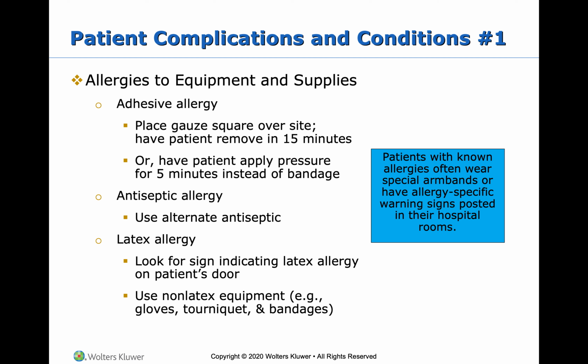And a lot of times I will come in behind other phlebotomists that have used paper tape, and I will notice that it is tearing up a patient's skin. So they don't necessarily have an allergy to it, but they've had it on and off so many times in the time that they've been in the hospital that it's actually starting to rip the skin, and you'll be able to tell if you see it. Their skin just gets really irritated from the tape, and so I will choose to put Coban on instead.